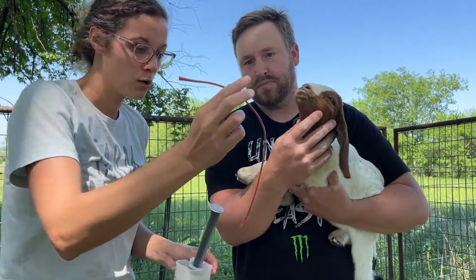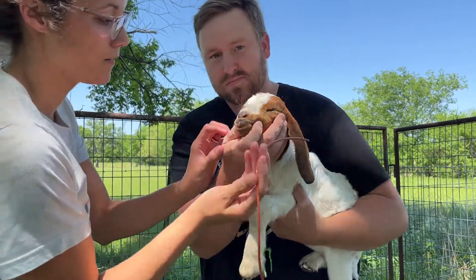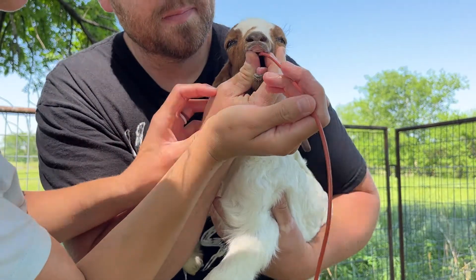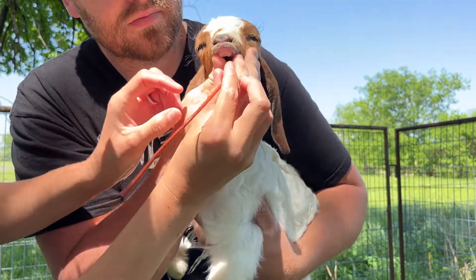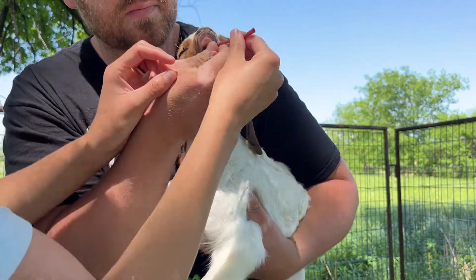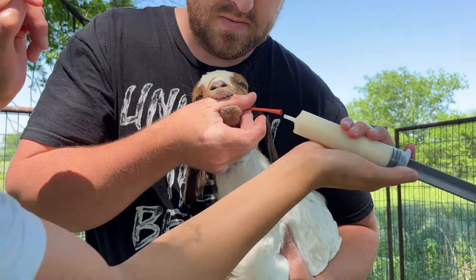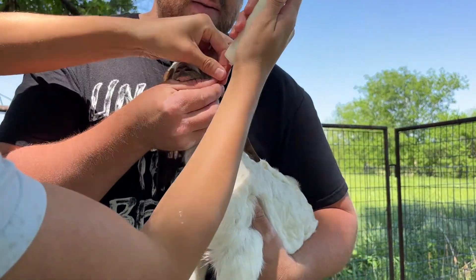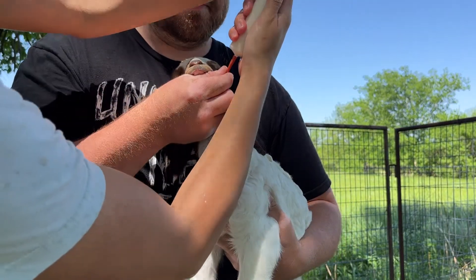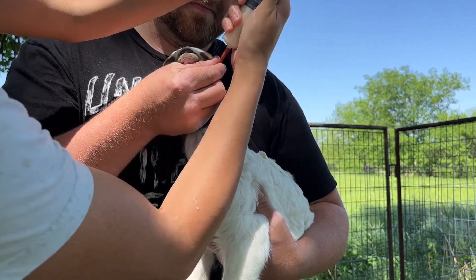We got this stomach tube from our local vet — helps to get it a little bit wet in the milk. I just try to hold the mouth; we stop any time he cries. Once she gets it all the way in there, I just kind of hold it to keep him from chewing on it with his teeth. We do a little push of milk to make sure he doesn't cough — if he coughs, we pull it back out and then go ahead and push the rest in once we're confident it's in the right place.